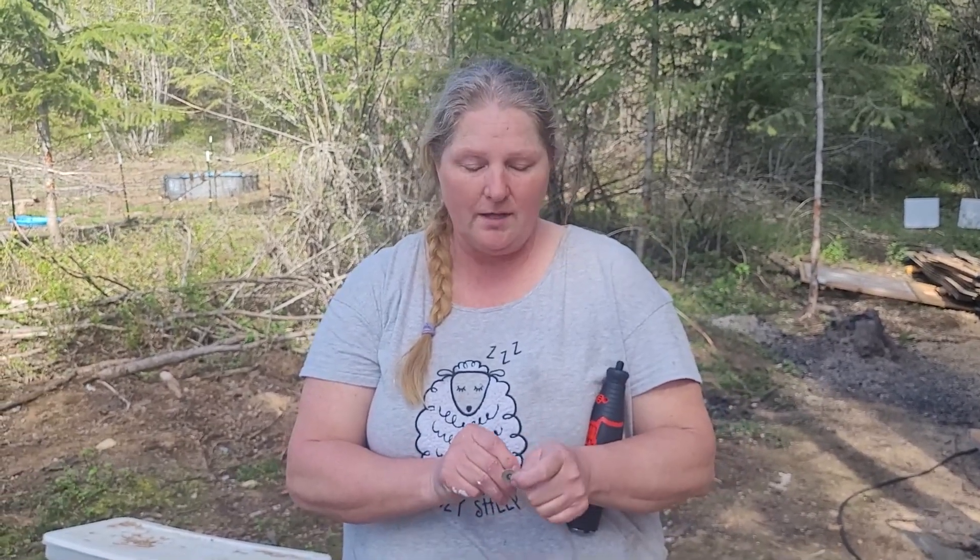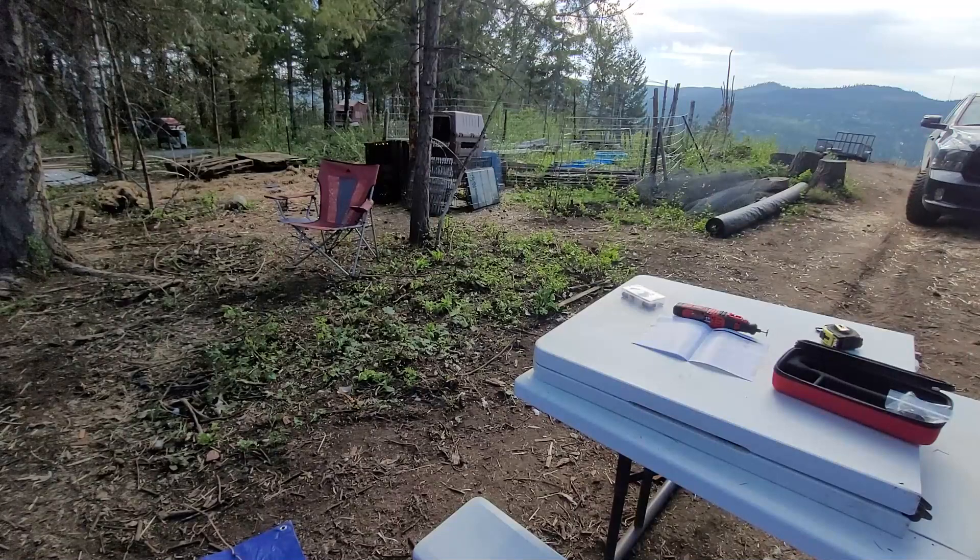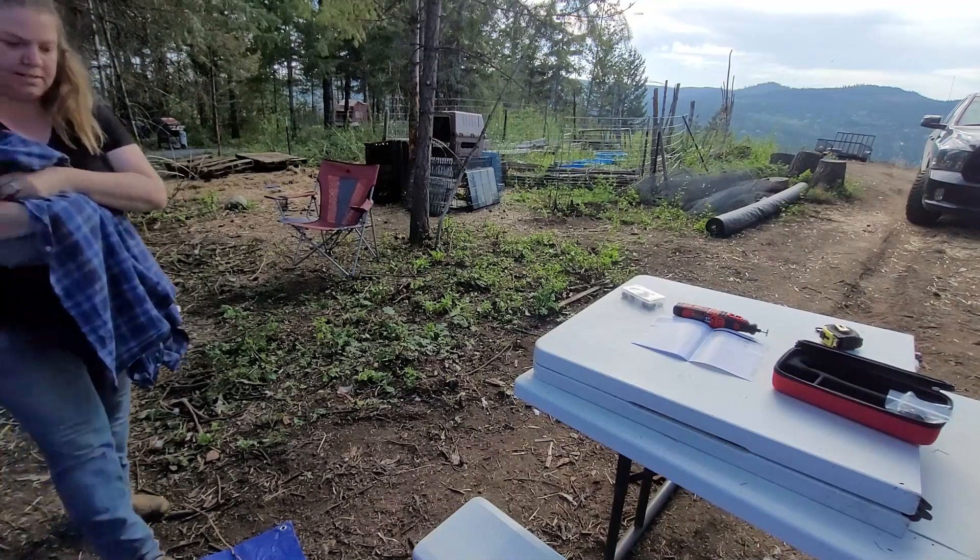We were going into town anyway, so I grabbed one of these tools. This is what was recommended — this is what the vet used. So we're going to catch her and take you guys along with us cutting her teeth. You're skin and bones, girl. I've got to get you some delicious protein.